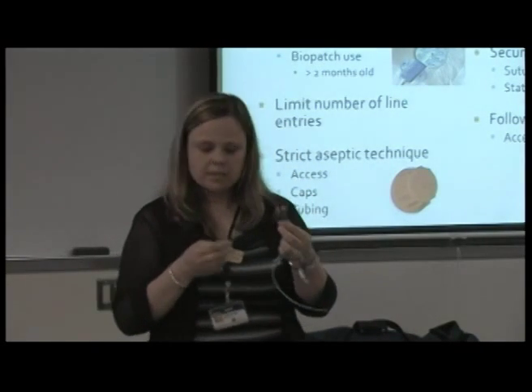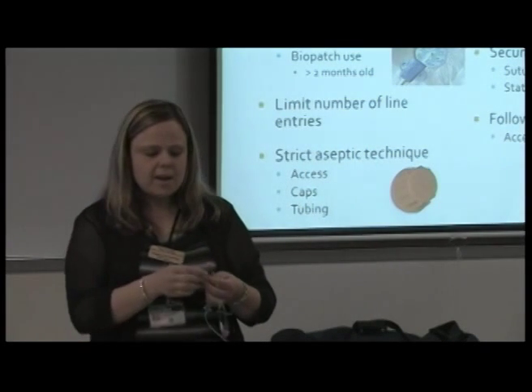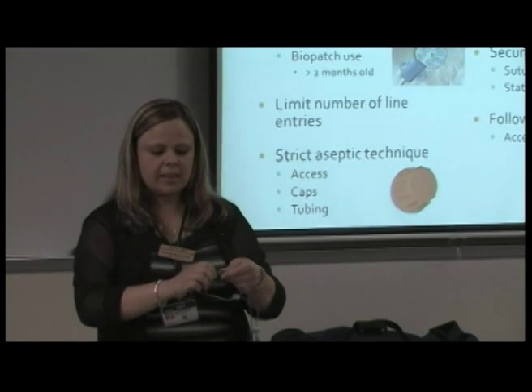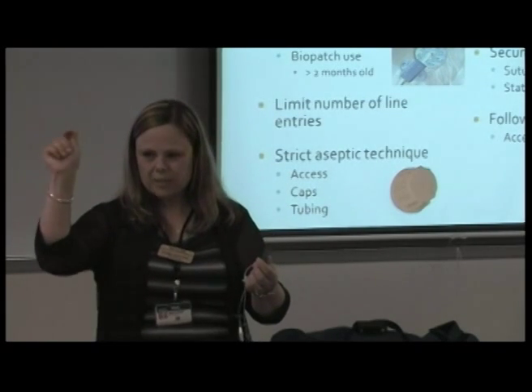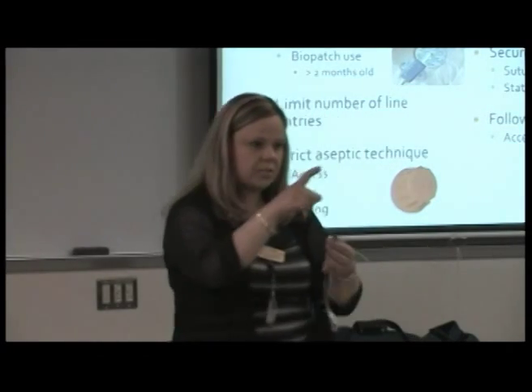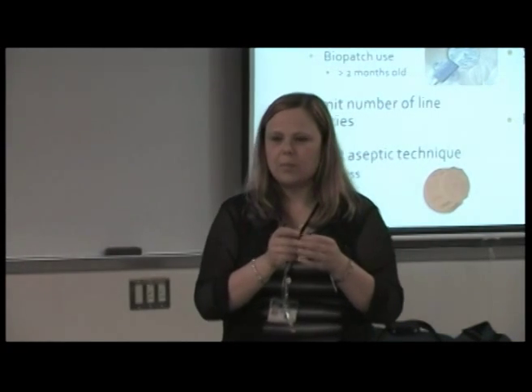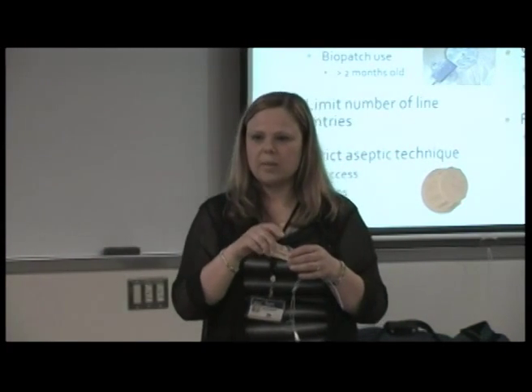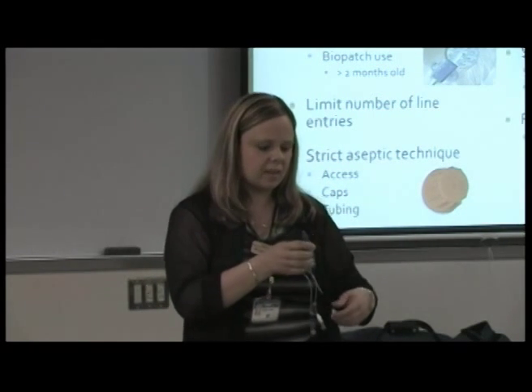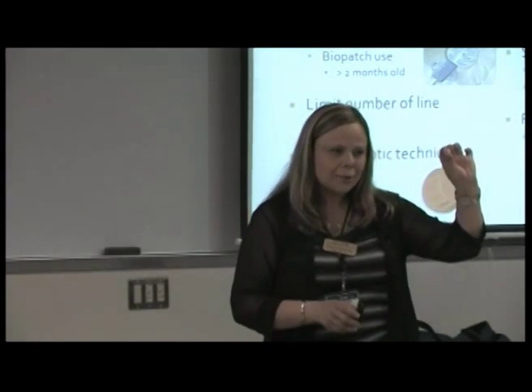So you may see this when you pick up a patient on the ambulance if they have a PICC line or a central line on their chest, and we would just take that off to access that. However, this is one-time use. We can't put it back on. So it would be best to hook up a line to this device, or to just make sure that we're really scrubbing the hub 15 seconds with the alcohol before we access this device again. I don't know that all of our ambulance services are going to have these caps.